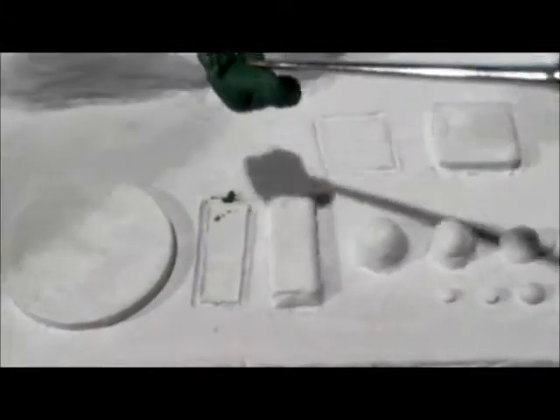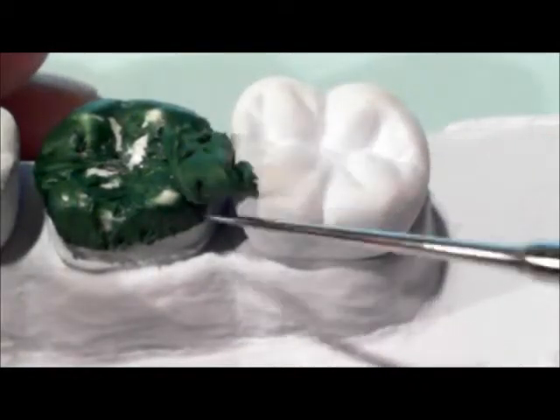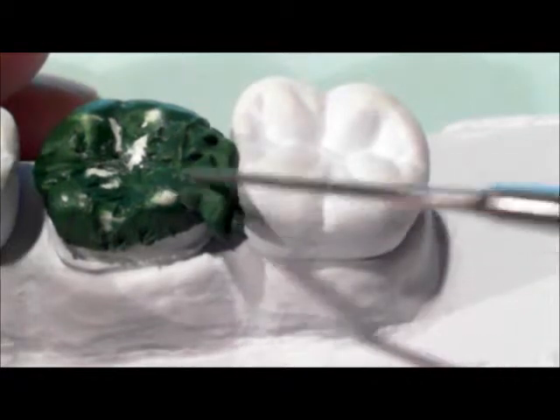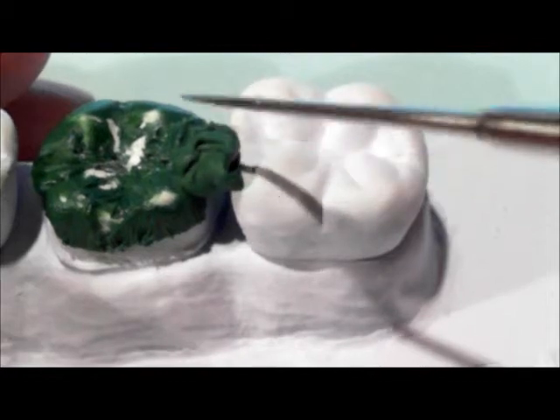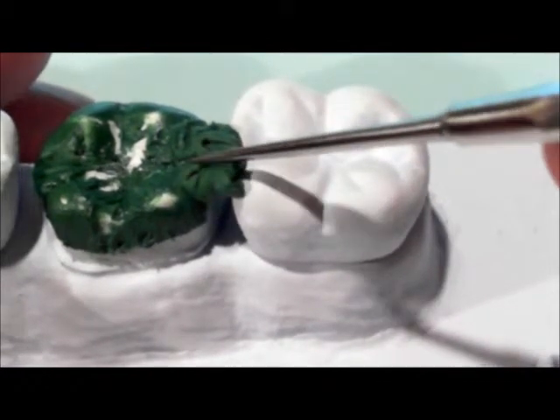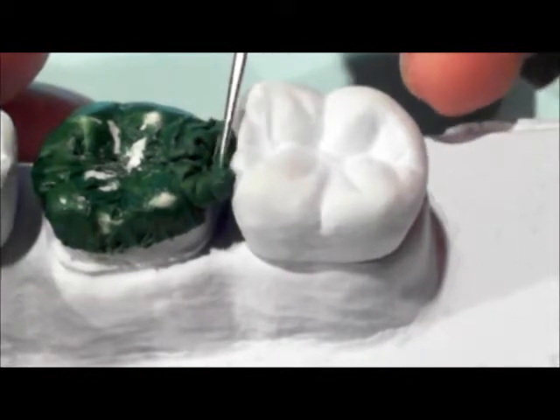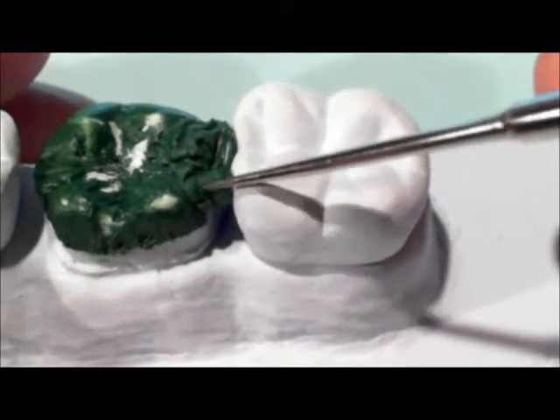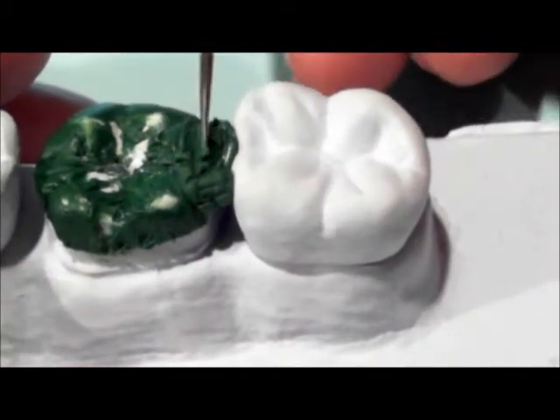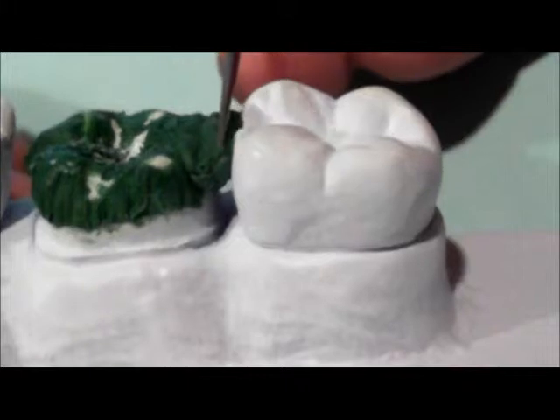And what we're going to do, come over here, and we're going to place it right in between the interproximal spaces. Right between here. Okay. Sometimes the disc that we made, you have enough to do that. So we're going to just put a little wax in here and smoothen it out. Smoothen it out here.